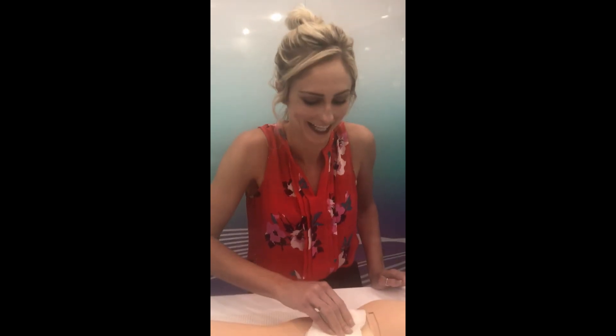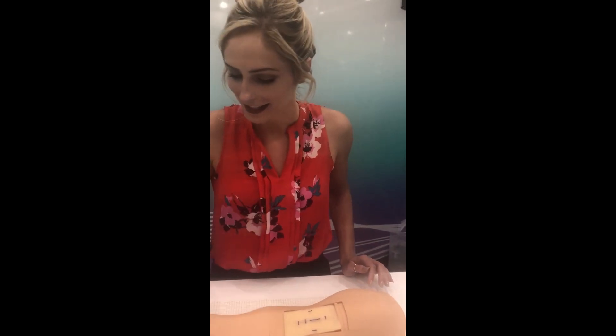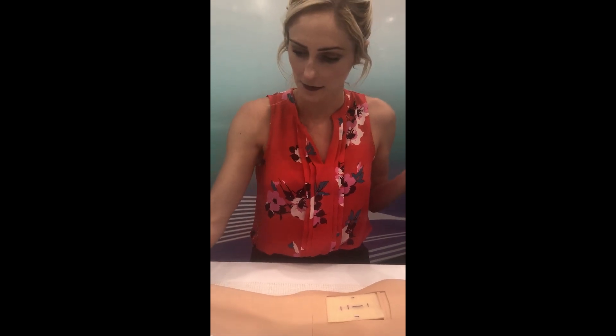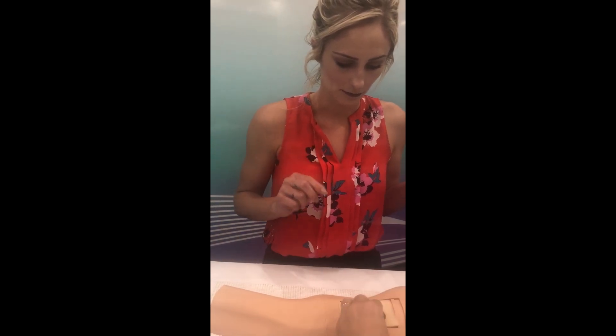So now we dab it. I'll get better at this, I promise. Dab it — first time! And then we put steri-strips on it and tape it over. So we get the tape over — like this. Done. And then the transmitter will go over that. So it'll sit just like this on the skin. Turn it around.